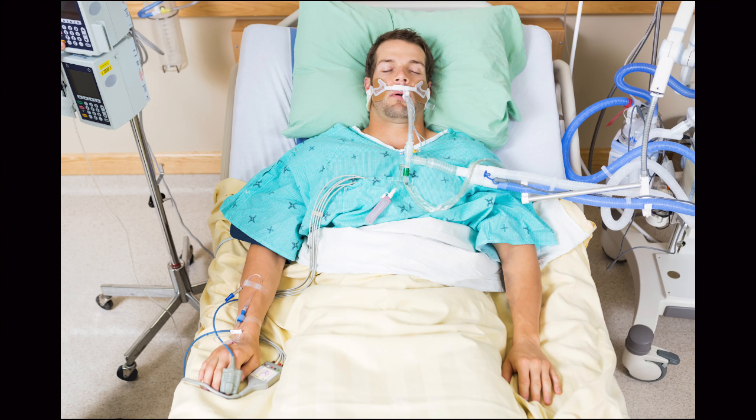After the iron lung was invented and used, there were many advances in mechanical ventilation. In the 1930s, physician scientists started working on positive pressure ventilation, which is the type of ventilation we use today. These earlier machines were very big and bulky and were only utilized within the hospital setting. The way positive pressure works, as opposed to negative pressure ventilation, is that the machine delivers air directly to the patient's lungs under pressure. This requires a breathing tube to be placed through the patient's mouth directly into their trachea — known as an endotracheal tube — to connect the patient to the ventilator.